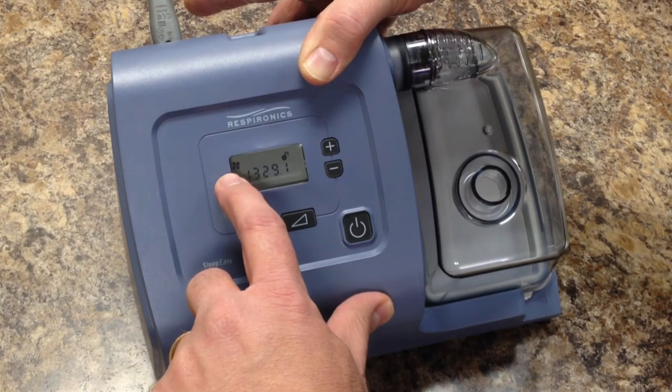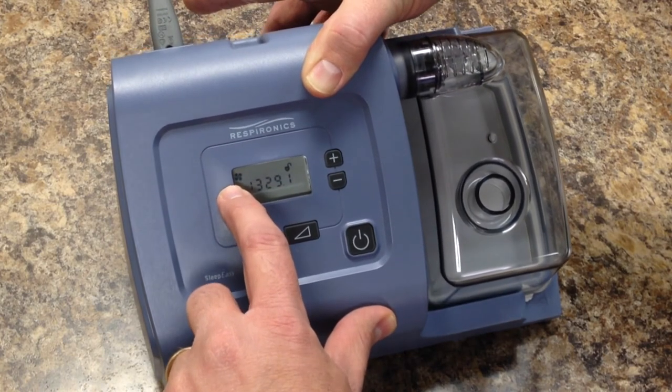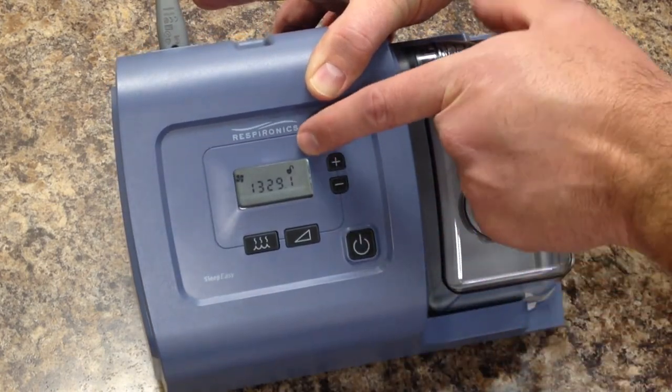Here we go. Up in the upper left-hand corner, there is the little fan, and here's going to be your total hours.